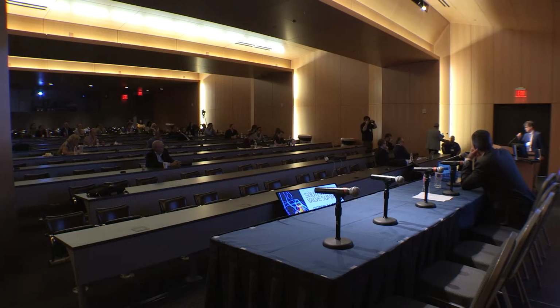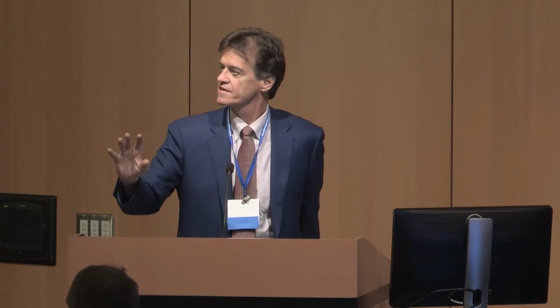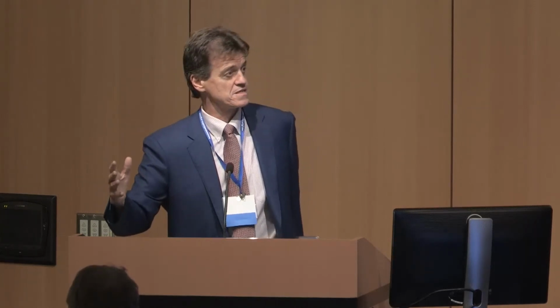And to me, the unmet need right now is that little old lady with MAC. The problem is they're very sick, and they will die if we don't fix it. They're miserable, but they'll also die if we don't. A clip is not even an option. It causes mitral stenosis. Same for a PASCAL.